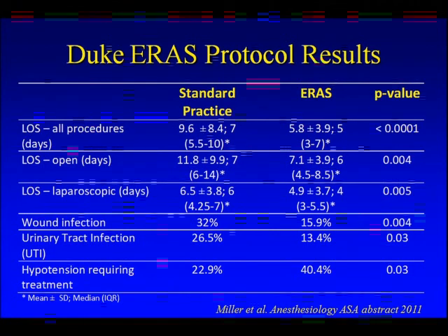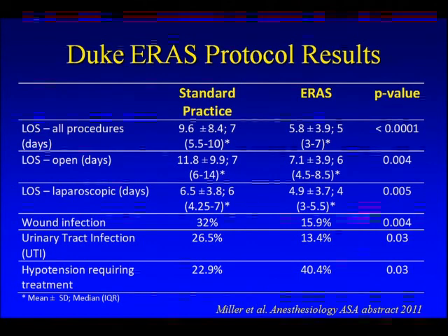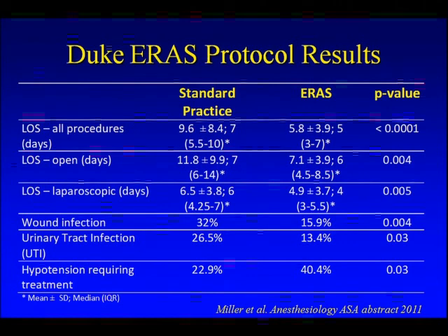Initially, we collected some baseline data, implemented a training period for about 3 months, and then implemented the protocol. So this was the standard of care before the implementation of the protocol, and this is 6 months after implementation. You can see the length of stay was significantly reduced, even with laparoscopic surgery, where, as you would imagine, it is much more difficult to show a difference. We were still able to show a difference in length of stay, and a reduction in wound infection as well as UTI, but we do need to use a slightly higher incidence of phenylephrine because of the epidural, which wasn't the standard of care in the baseline group.